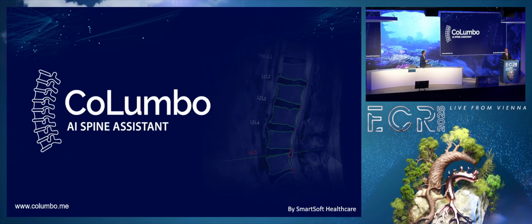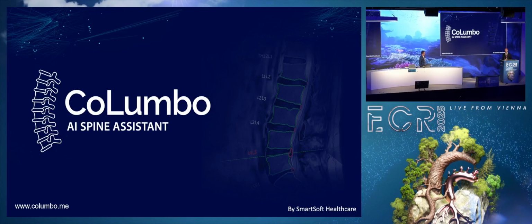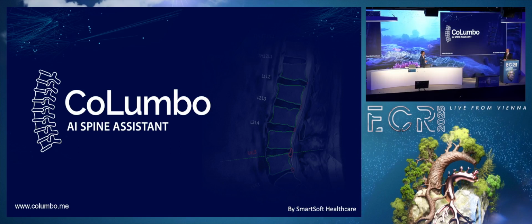Thank you. I think that's a very good question. So we are a large group of radiologists. This software is available in the PACS. So once you open up your lumbar spine exam, the annotated images will be there with the measurements, and also the report generated by the AI is available. The radiologist can choose to use the report. It's like a trigger in our reporting system. When you say automatic report, it will pop up, and then you can change whatever you want to change.